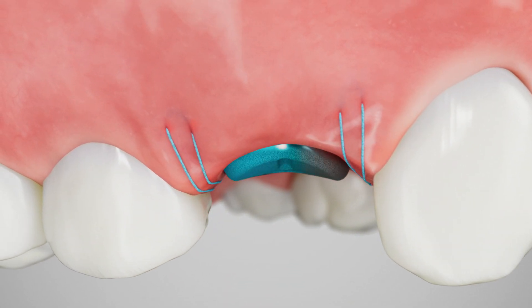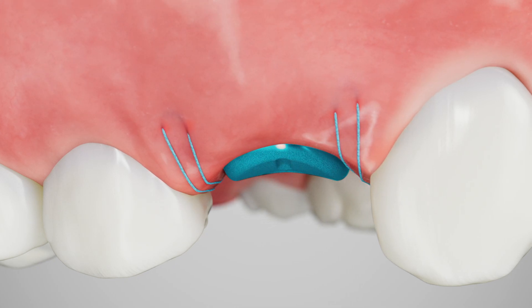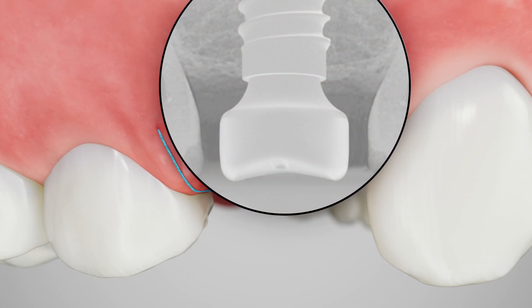Ensure that at least half a millimeter of the abutment is left exposed above the soft tissue. This geometry will be captured by a scan or impression. At this point, a radiograph can be taken to ensure the abutment is properly engaged.